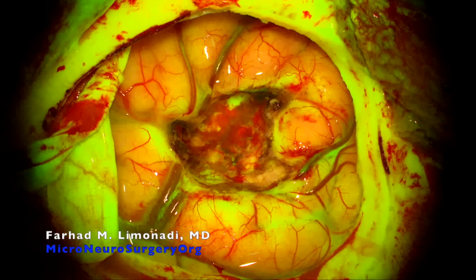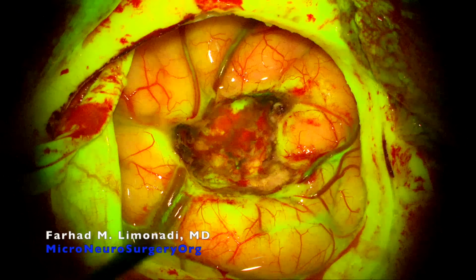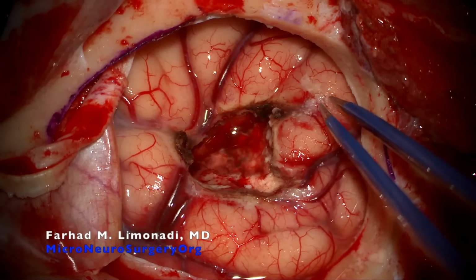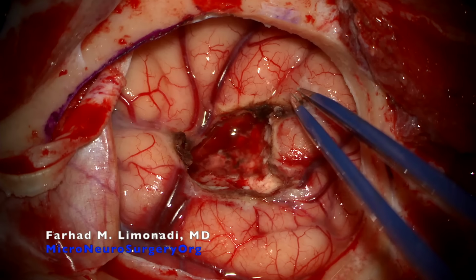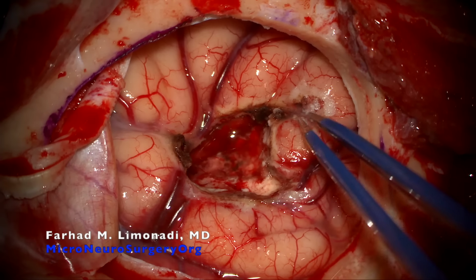Sodium fluorescein guided microscopy as well as high magnification visualization was used to ensure there was no potential residual tumor. Considering the possibility of false positives, small areas suspicious of being studded by tumor cells were treated with low current bipolar cautery.